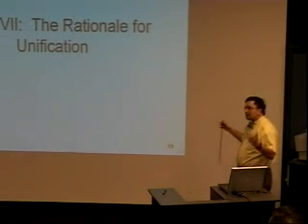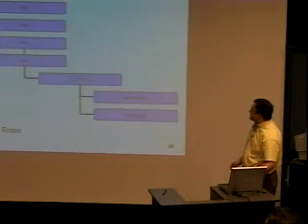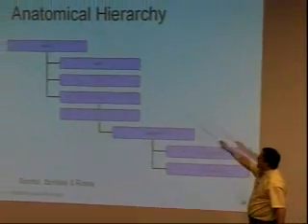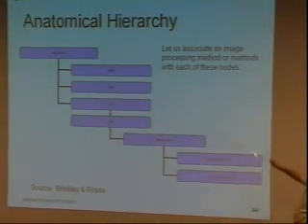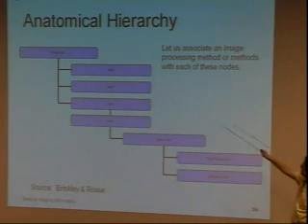So what's the rationale for unifying all of these various methods together? Well, we can look again at Brinkley and Rosse and their anatomical hierarchy. And what I'm suggesting is let us associate an image processing method or methods with each of these nodes in this anatomical hierarchy.